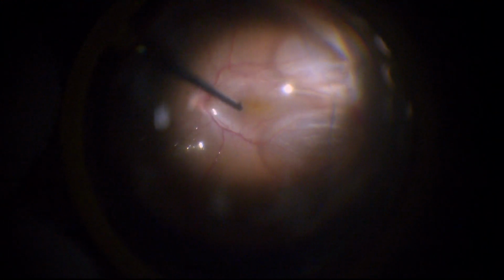So I tried to make that opening a little larger by excising surrounding retina, and there was a surprise. The surprise was that this was not a crystalline lens, but rather some amount of PFCL which had trickled into the subretinal space through this retinal opening. And once we could pull the retina apart, I could see that there was a bubble of PFCL there.